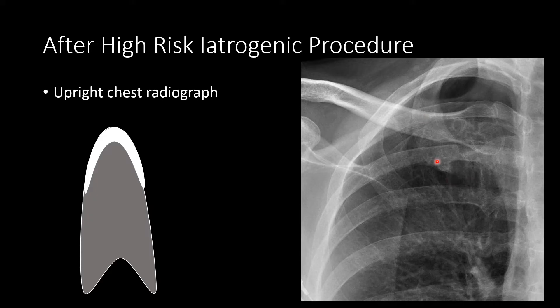If we blow up this particular patient, we can see the pneumothorax as indicated by this pleural line that extends across multiple ribs and rib interspaces. We can see the lucency with absent lung markings. The yellow line highlights that pleural line. The yellow arrows show the pleural line in the rib interspaces, and the blue arrows show the pleural line crossing the ribs.